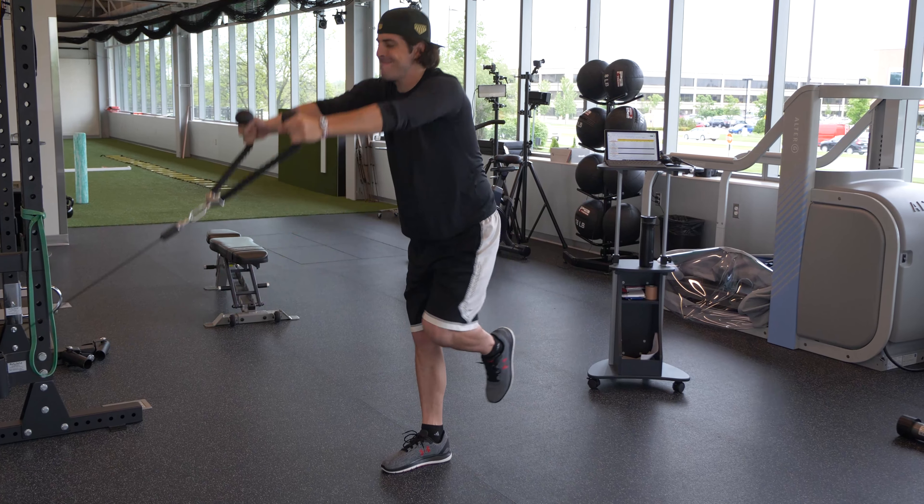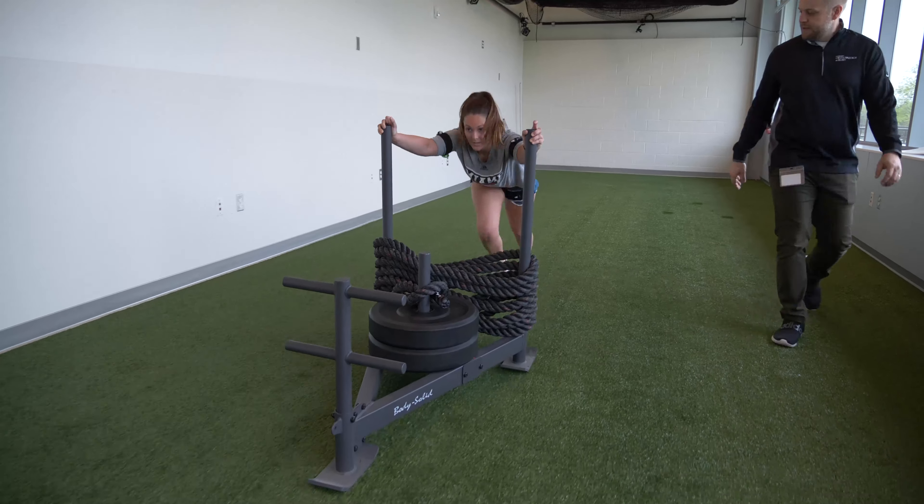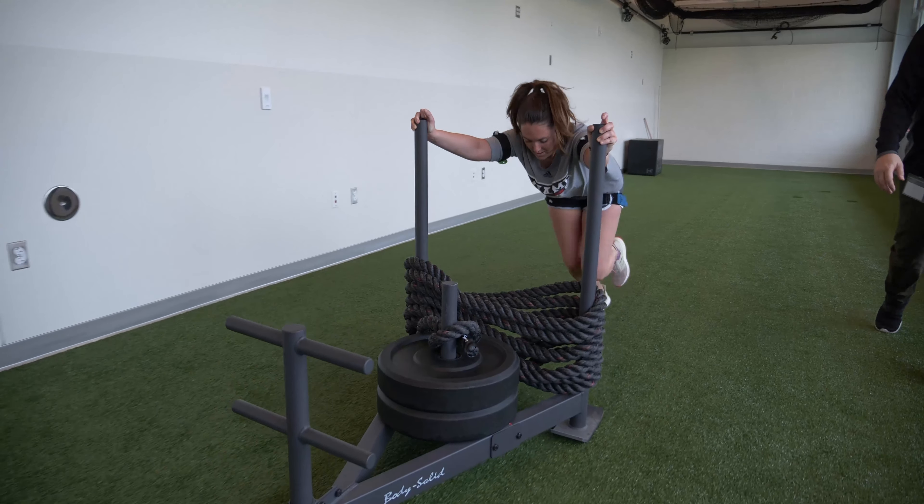As they get more advanced, we can have them keep the blood flow restriction bands on and do functional athletic activities like pushing a sled, doing kettlebell swings, or squatting. For some patients, that might be putting the bands on and doing some walking or going up and down stairs. All of these are extremely functional activities, and we can maximize strength gains by using blood flow restriction.